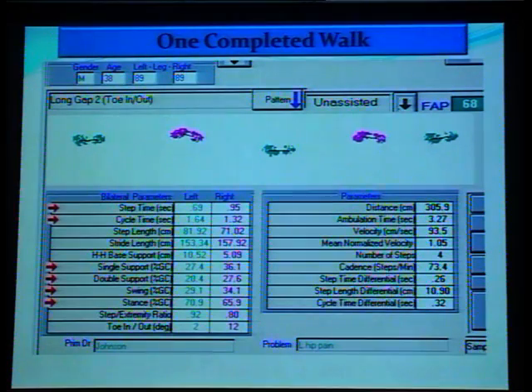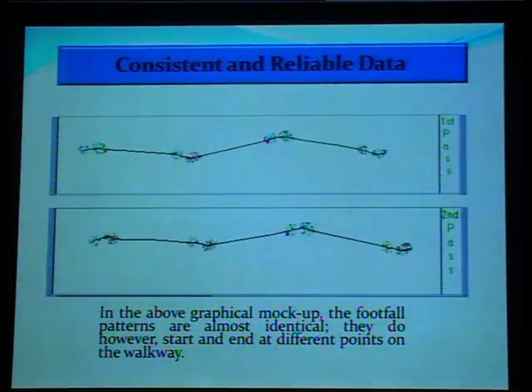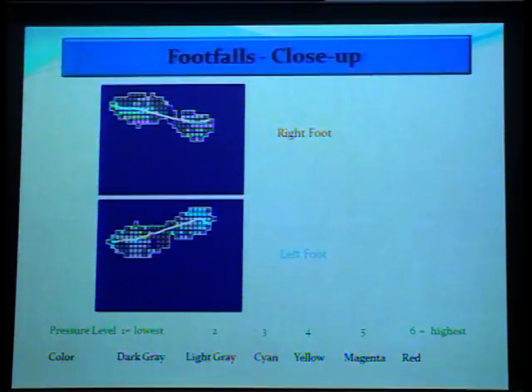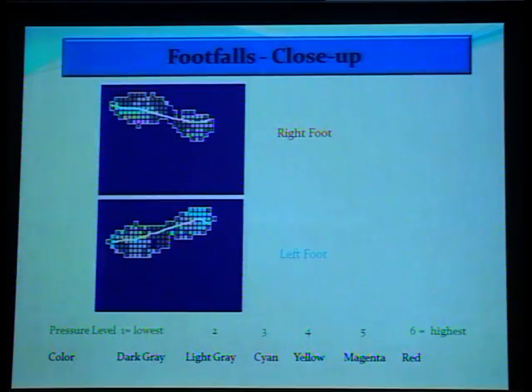Okay, and the importance of this footfall is how your foot impact is. It gives it to you in color. It indicates where you put your foot. So it gives an immediate understanding of where he is putting too much pressure, which you get on footfalls.